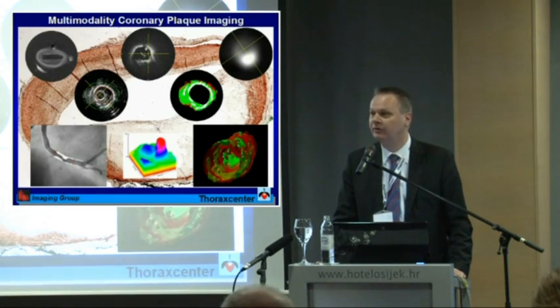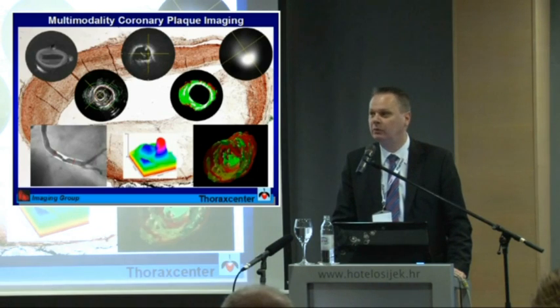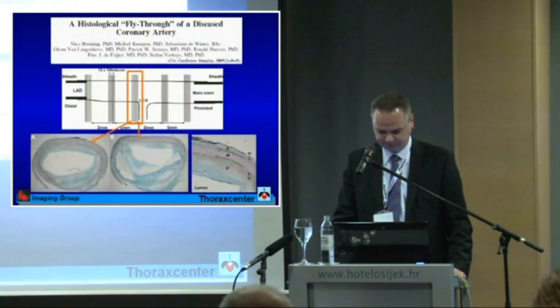We can also do some non-invasive imaging by MSCT and with MSCT-derived techniques. And you could also do something with MRI, but that is still in its infancy because that is still impossible to perform in moving coronary arteries.